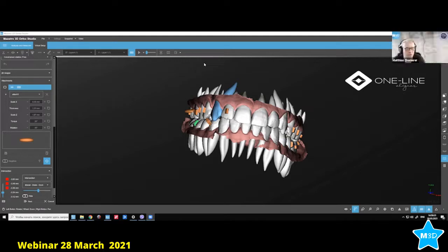Will that hook break out of the model? I just showed you. This model which I showed you is actually after the suck down, so it didn't break. So you can understand that. No problem. No more questions.